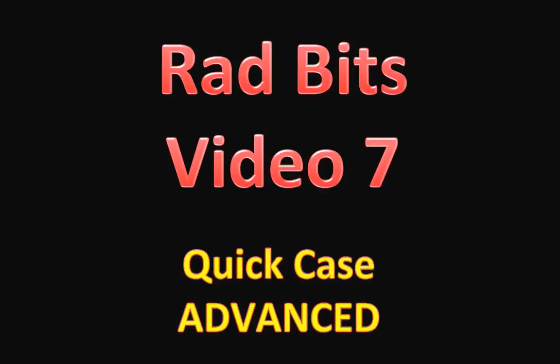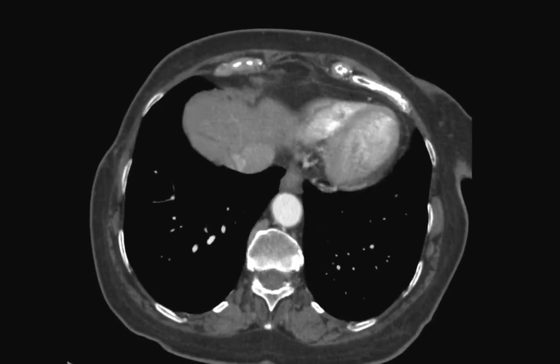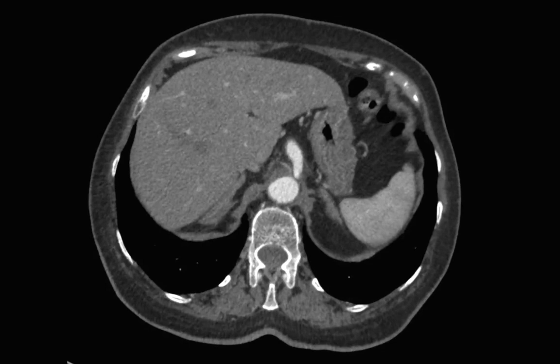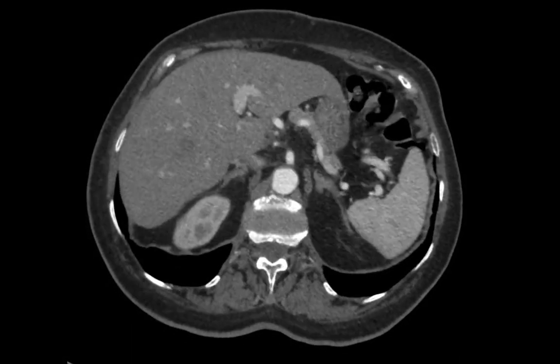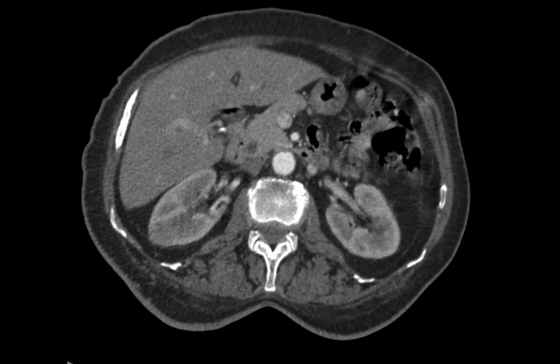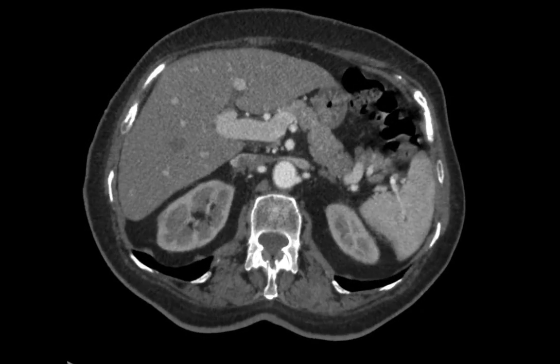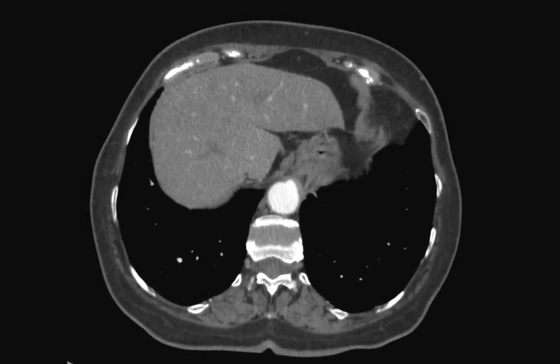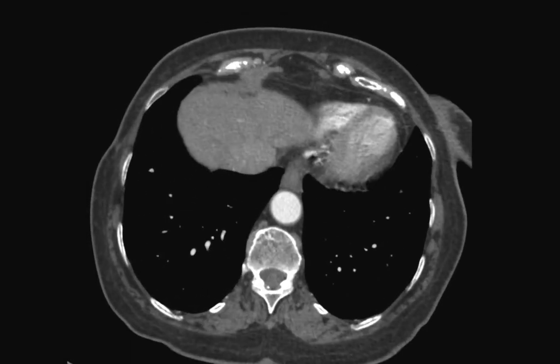Welcome to a new advanced quick case RadBits video. We will do today's case in a different way. I'll give you the chance to look at the stack of images, try to detect the abnormality and decide for yourself what would make the most likely diagnosis. You could pause here and try to think about what you saw before we go to the answers.